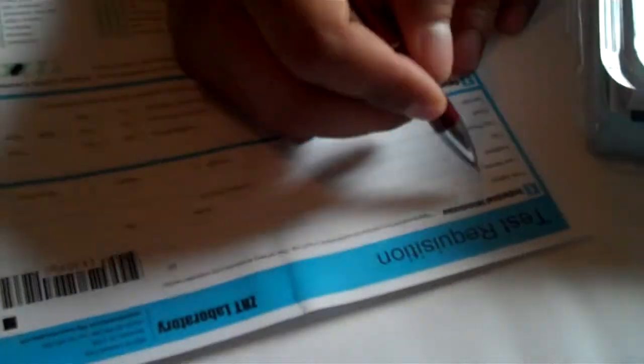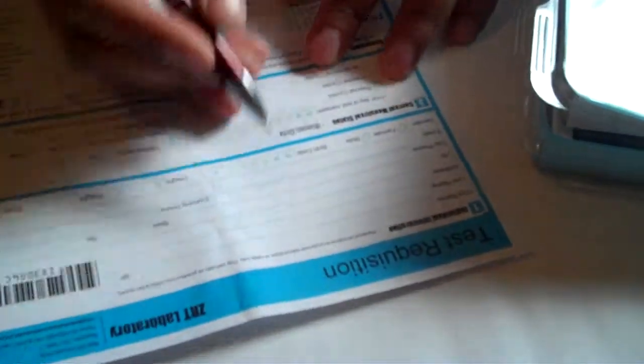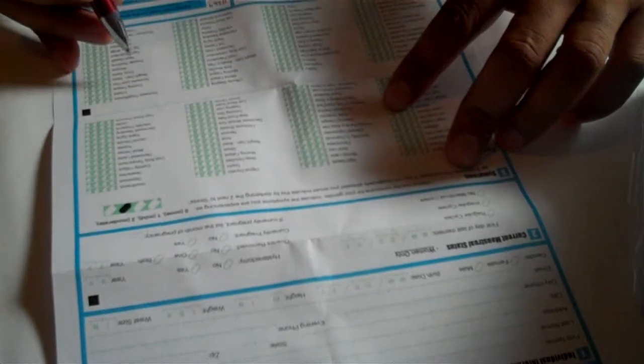So you get your test. First thing you have is an information sheet. Take the information sheet and fill out your information. Skip this second section. Go over to this section for men and complete that.